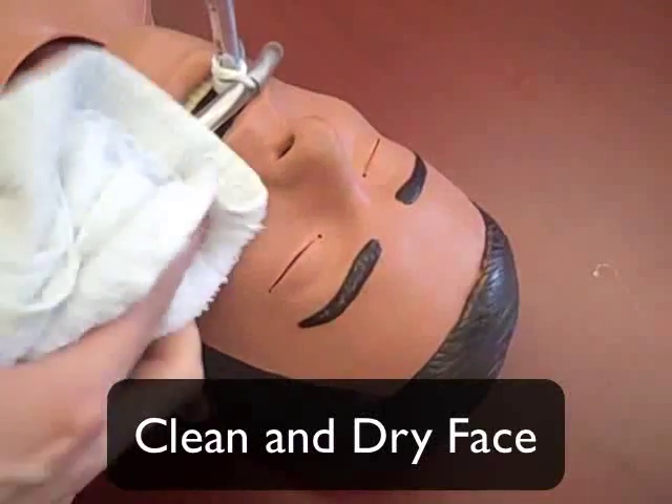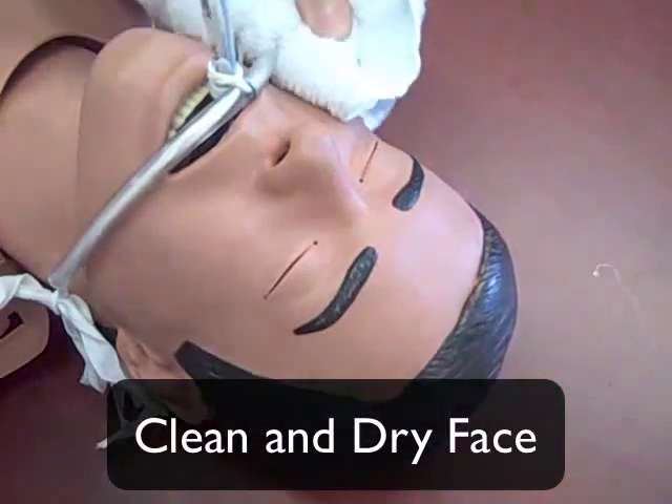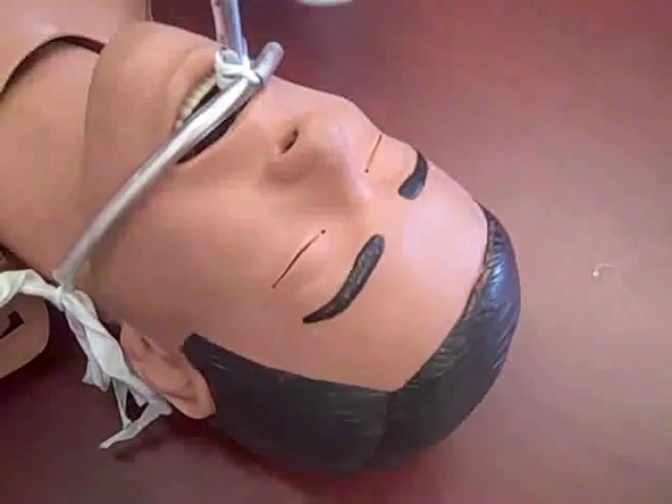Make sure the face is clean and dry before application. It should also be free of any facial hair. This product can remain in place for up to 7 days.